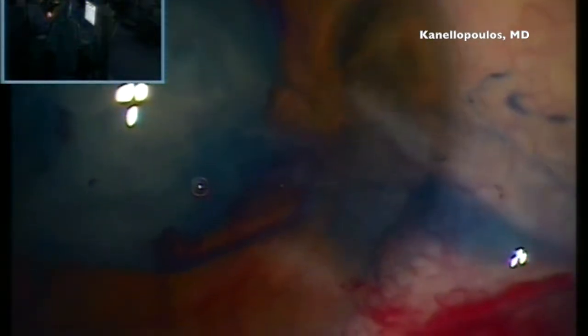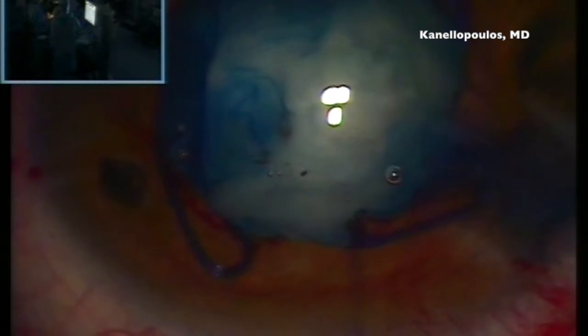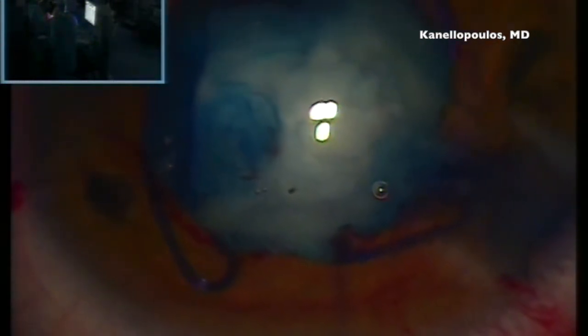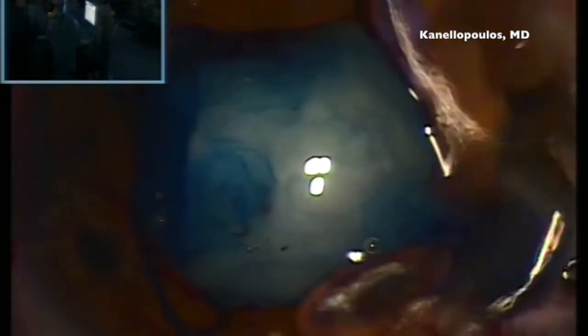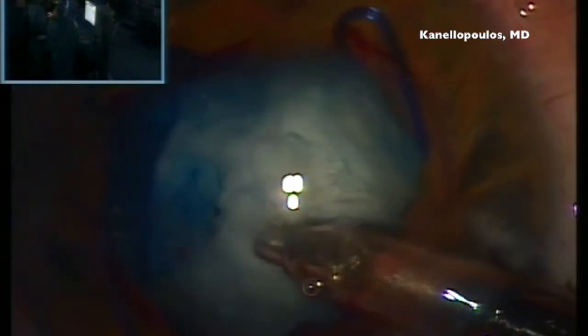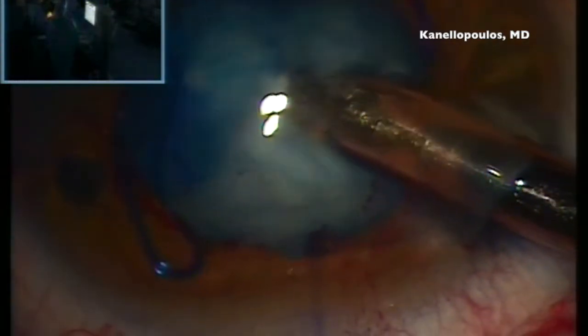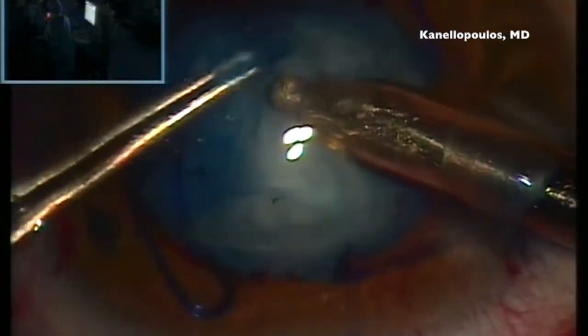And sharing with you some of the intricacies of this particular uveitic eye, which, as we mentioned before, has probably gone at some point through a stage of intumescence of its lens, and following that, escape of the protein material through the intact capsule, and perhaps maybe a phacoanaphylactic stage. In my opinion, the lens should have been removed a long time ago, at the beginning of the iridocyclitis or uveitis episodes.